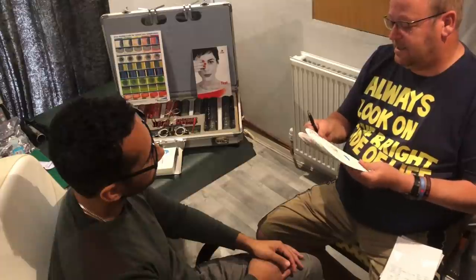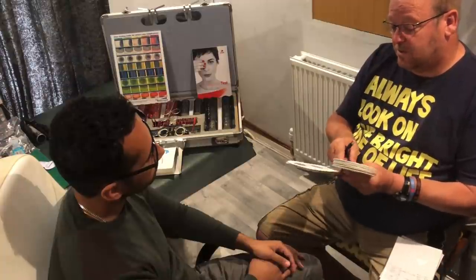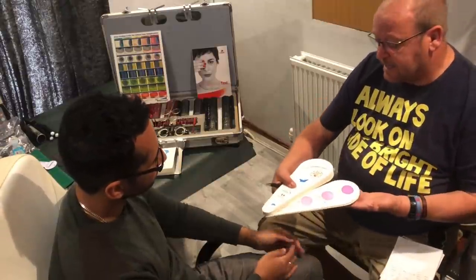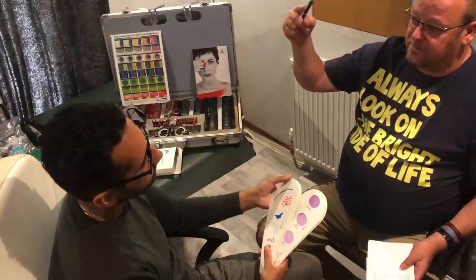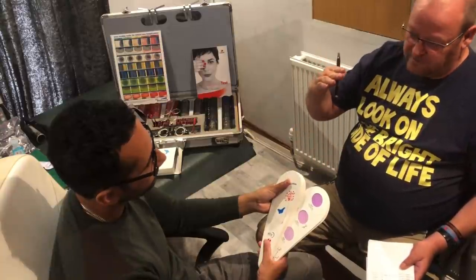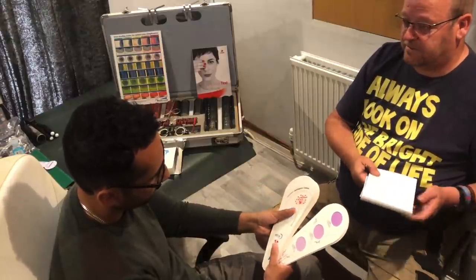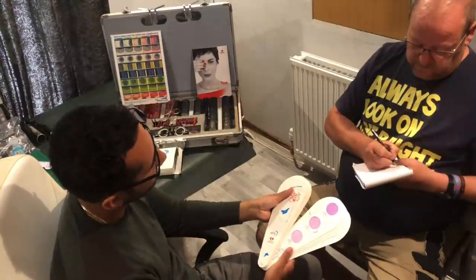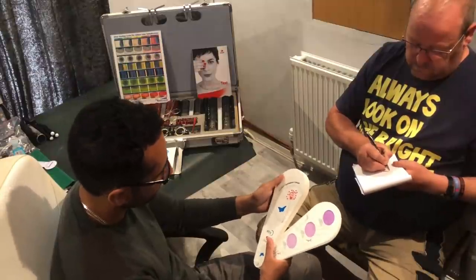The next specialist tint we call Orient — it's more of a lilac. I think this is good for a lady's sunspecs. Have you ever seen them where you've got three or four different colours, like a rainbow effect across the lens? So you'd go for the India and the Orient as two different colours and probably even put a third colour in with them, and they would make a nice colour for something special or something different. I'll certainly tell my wife about this option and get her to come and see you. But they're pretty, probably not for me at the moment.